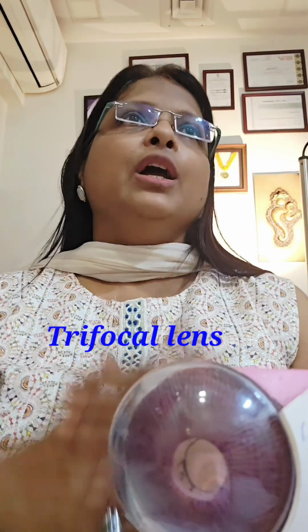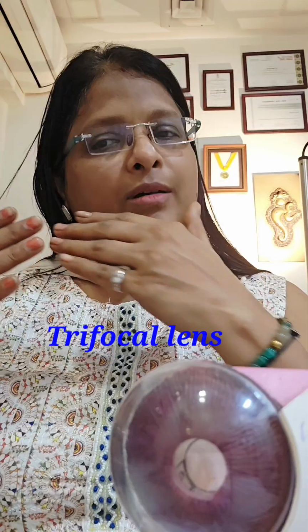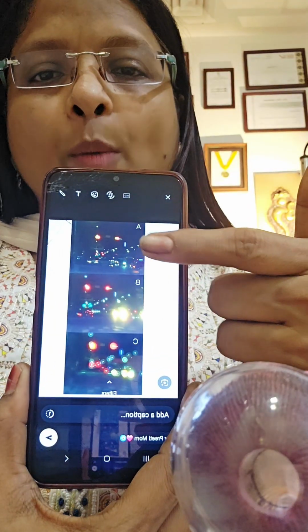Then we have another category of lens, and that is trifocal lens. Multifocal lenses were discovered after the monofocal lenses, but with multifocal lenses you have some problems that you may have to face. That is, you can see optical side effects.